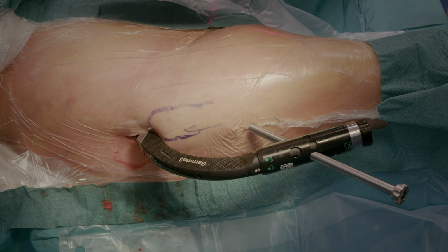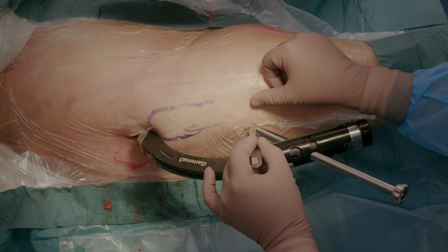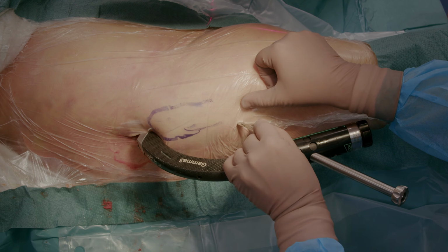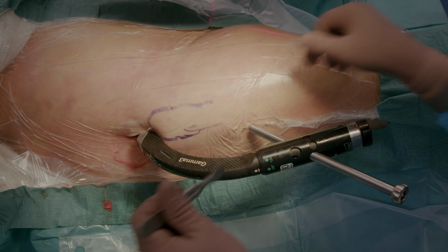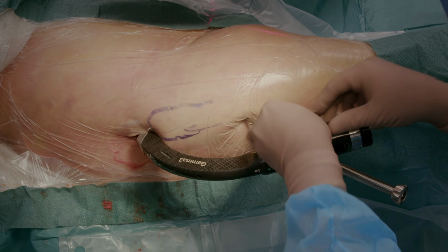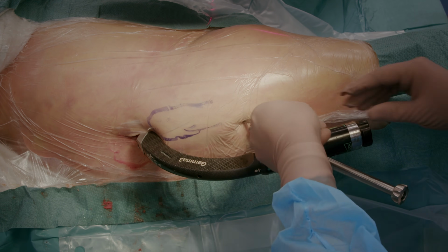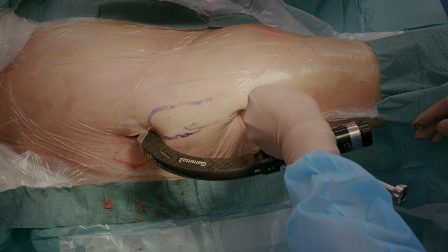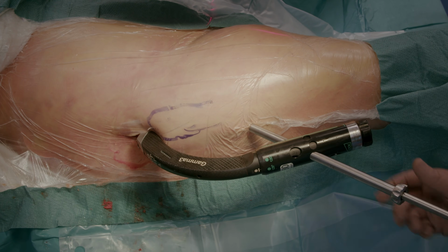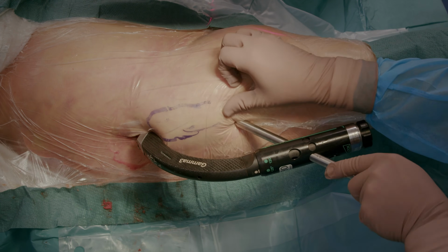Next, we start inserting the guide wire into the neck of the femur. We make the skin incision just here where the guide sleeve points at. We then use scissors, which can be used to go through the fascia and bluntly tunnel the root all the way to the cortex of the femoral bone. Then put the trocar into the guide sleeve.